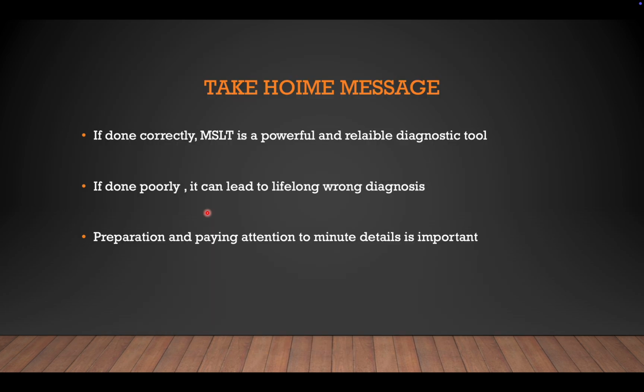So the take-home message for today's discussion was, if done correctly, the MSLT is a powerful and reliable diagnostic tool. And if it is done poorly, it can lead to a lifelong wrong diagnosis. So what we discussed is that preparation is very important, and documentation and technician input are very essential for proper diagnosis and interpretation of the results from the physician side.